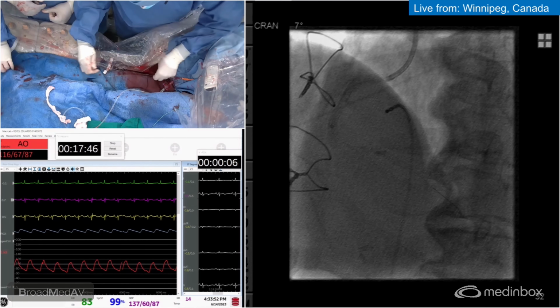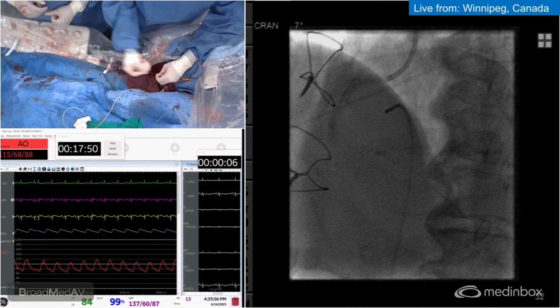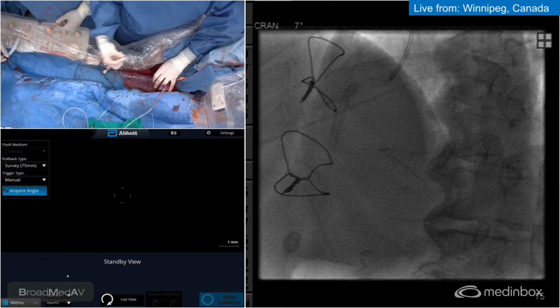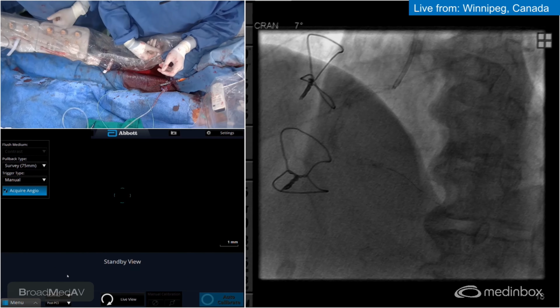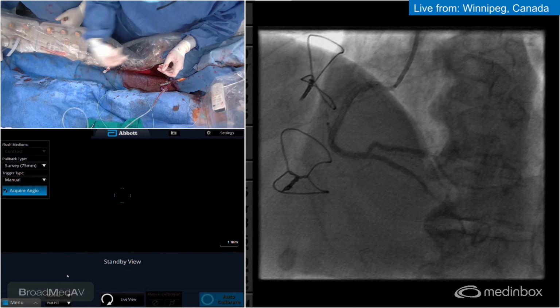This can maybe show the hemodynamics. I think our patient's comfortable as these are resolved. Yeah, those ST elevations that we had earlier are gone. We've turned down the pace wire. He's not pacer dependent. Let's do a cine now, just to show that for the live feed. Hold on, the guideliner is going to pop out of there. That's very nice.